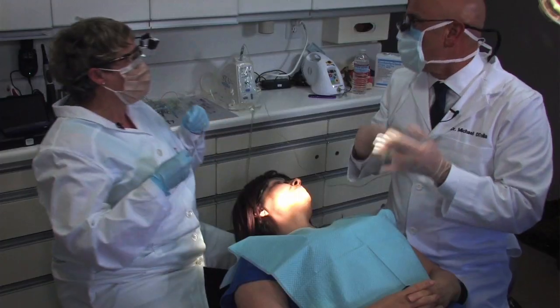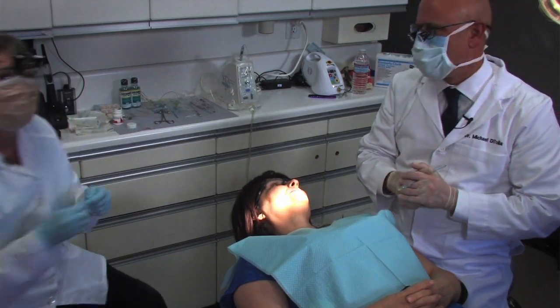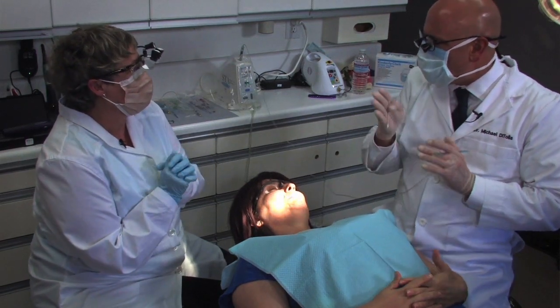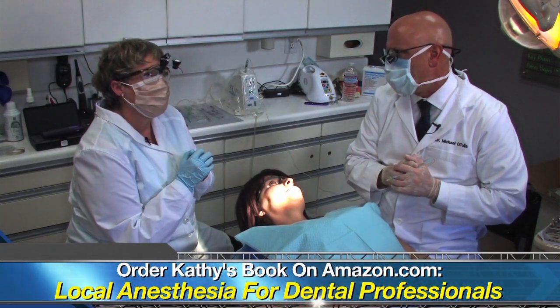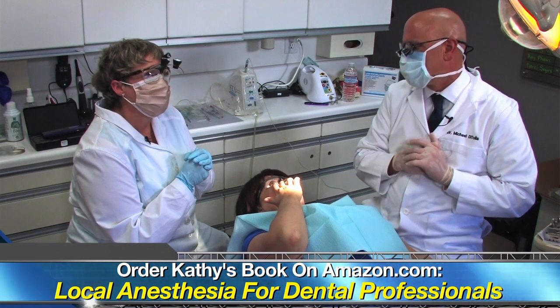I would have said absolutely not — you're crazy — if you'd bet me that it would blanch on the buccal. So it kind of travels through that palatal tissue, then through the interproximal tissue, and actually through the bone. We've got it moving right through the bone — it's a short distance into that maxillary dental plexus.